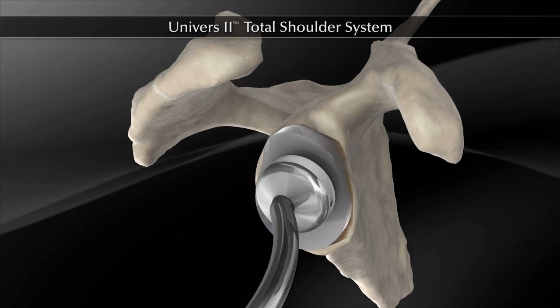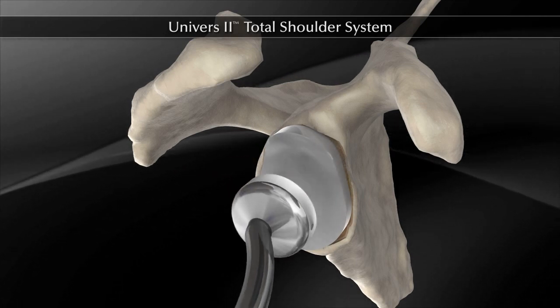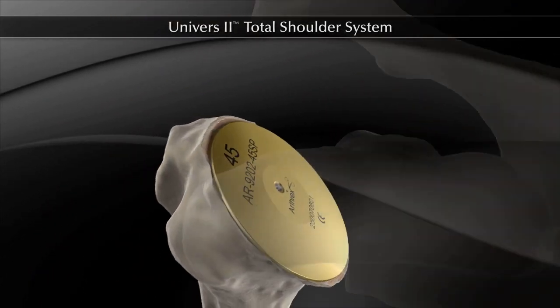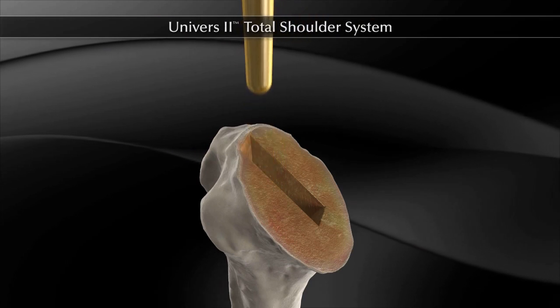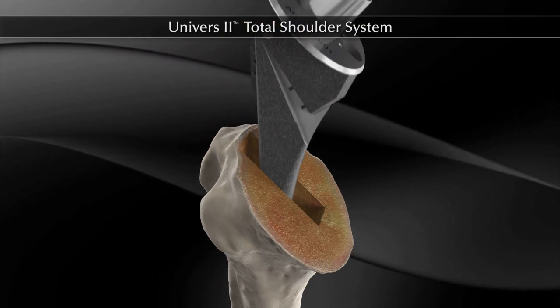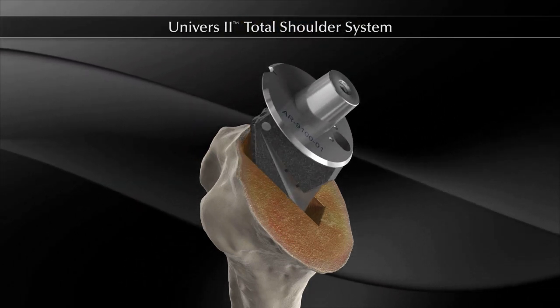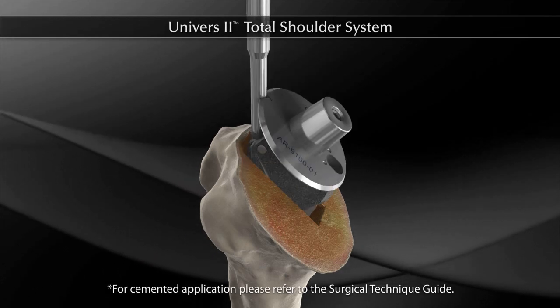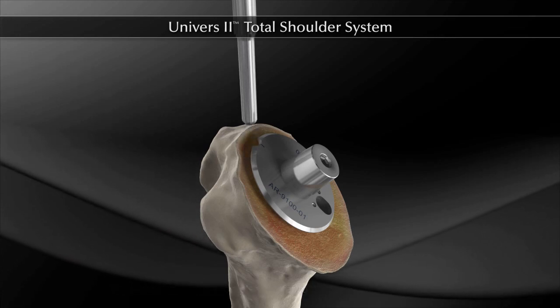Once the glenoid portion of the procedure is finished, attention is redirected back to humeral stem implantation. The resection protector and trial stem are removed. The appropriate size humeral stem is opened and placed in the prepared canal. The stem is impacted until the trunnion contacts the humeral surface and is fully seated.